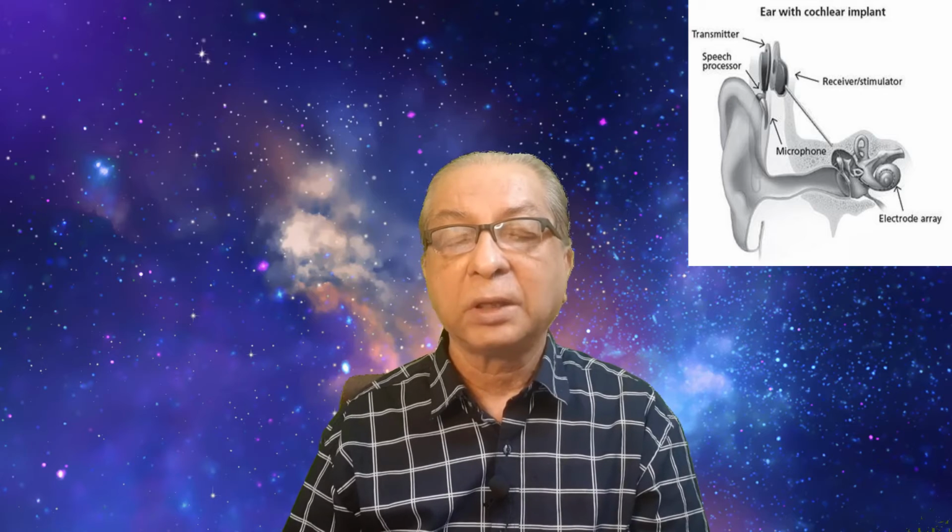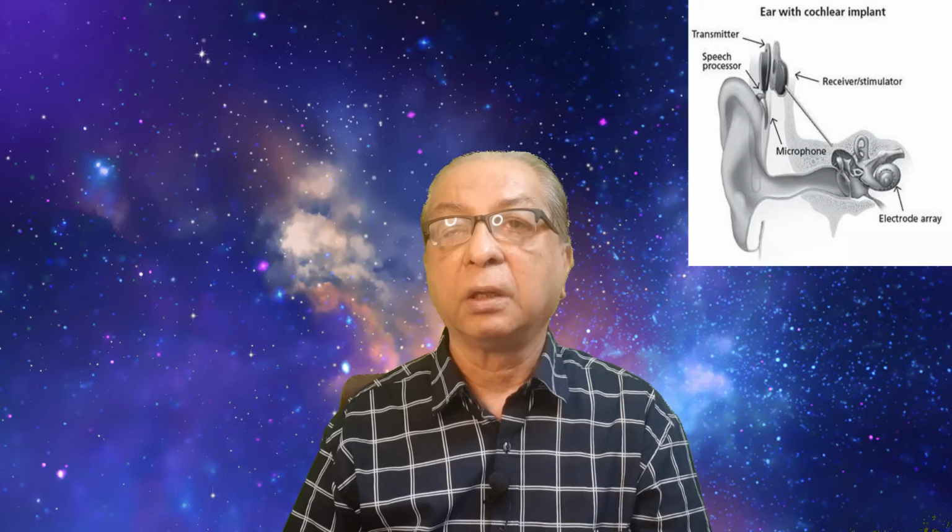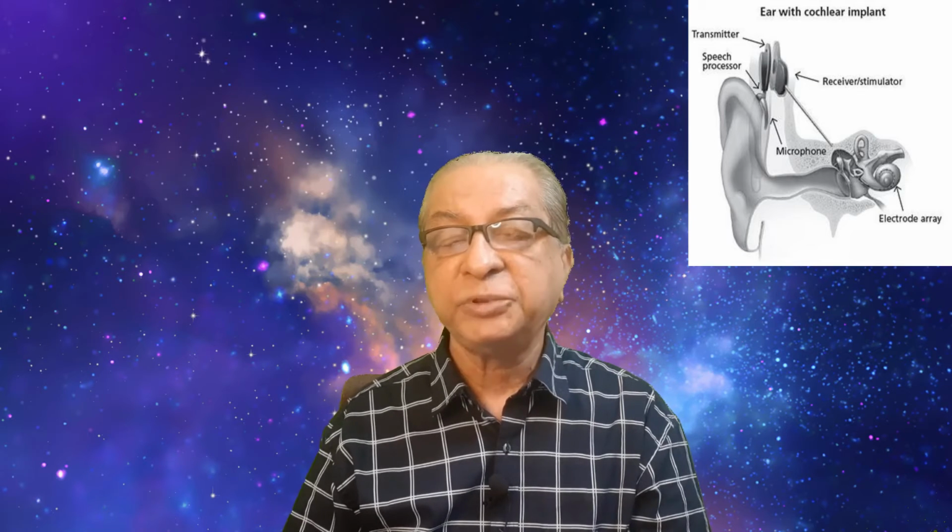These 3 bones are in connection with one another, touching each other, actually passing the vibration that is coming and hitting the tympanum of the ear and passing it on to the cochlea, the actual hearing, sound processing, recording machine. So these 3 bones are also artificially made, and they are known as ossicular chain devices.